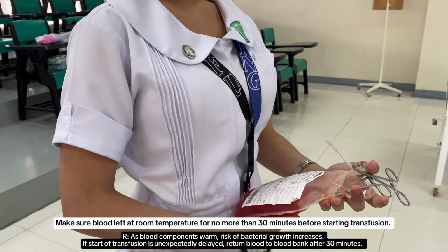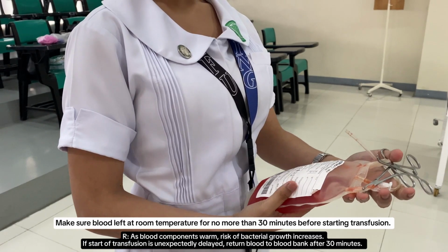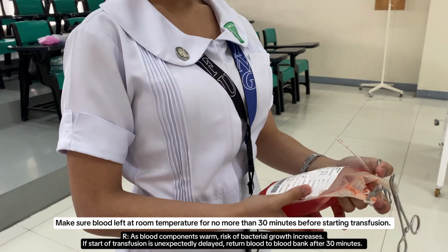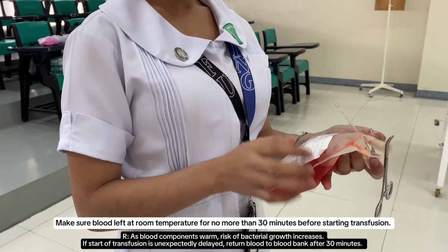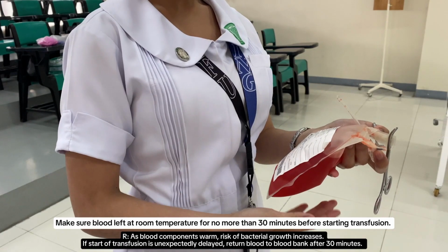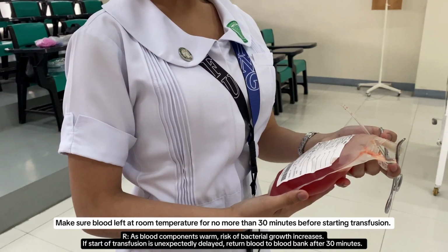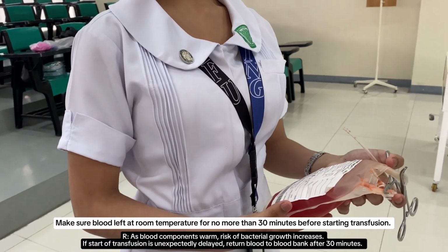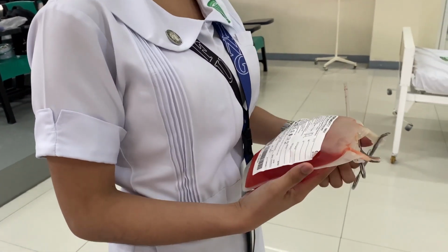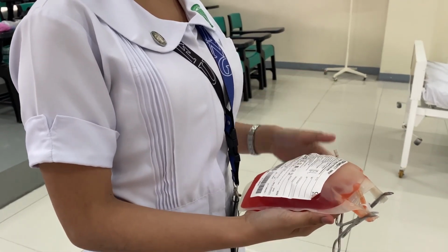Make sure blood is left at room temperature for no more than 30 minutes before starting the transfusion. As blood components warm, the risk of bacterial growth increases. If the start of transfusion is unexpectedly delayed, return blood to the blood bank after 30 minutes. Do not store blood in the unit refrigerator, as the blood may be damaged.